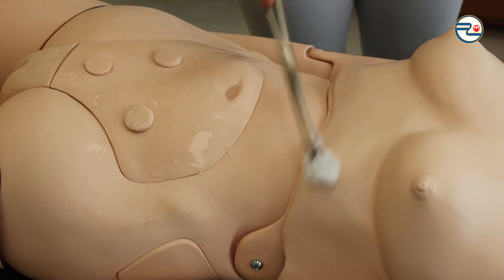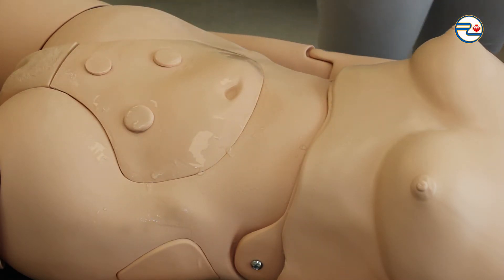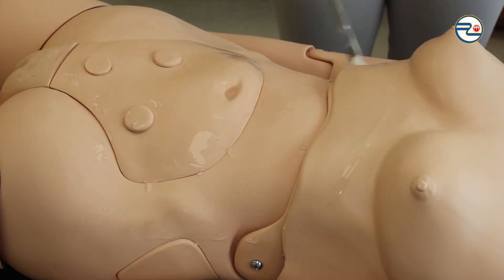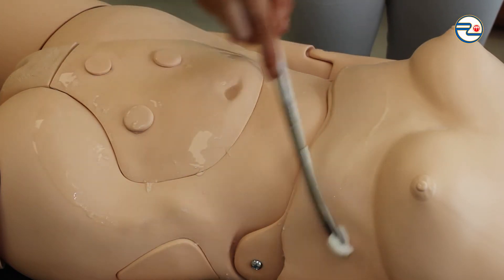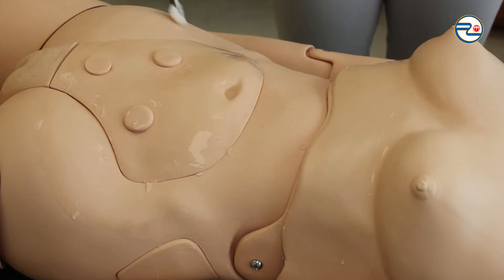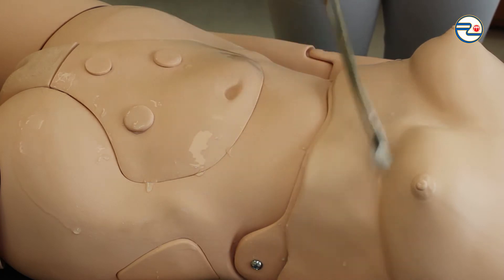The gauze should always be soaked with antiseptic. If it becomes dry, I change it to a new one and start from the place where I ended before. Throwing used gauzes into infected waste bins without compromising sterile conditions.